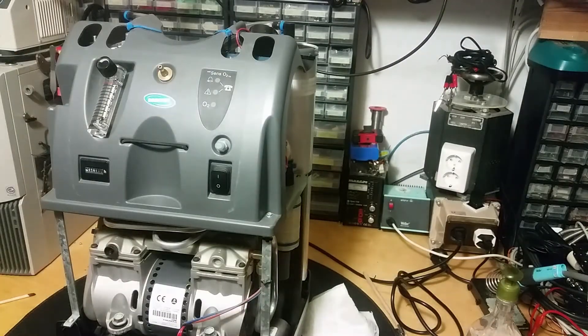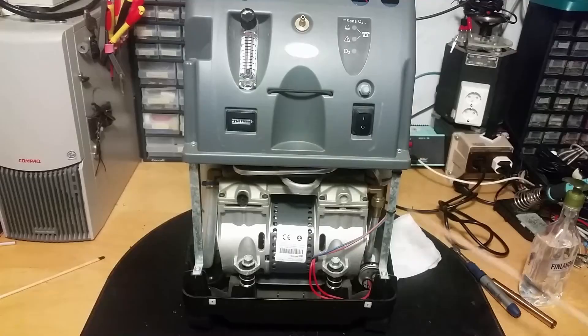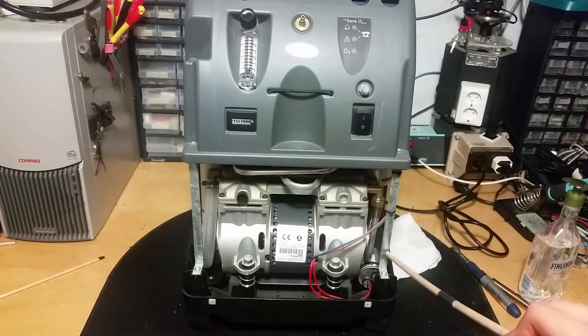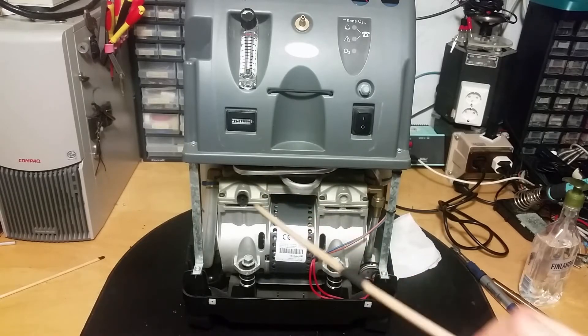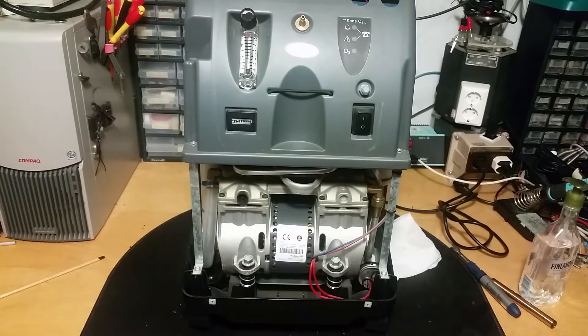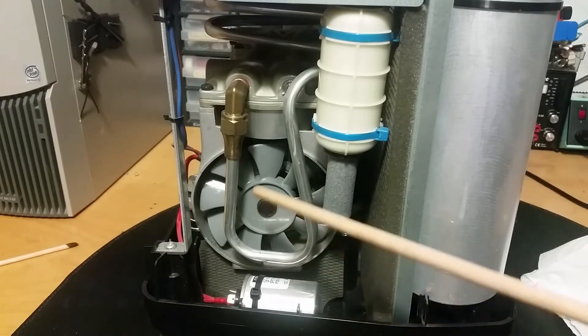Here you can see the internals. We got some sound insulation in here to make it a bit quieter. We got the compressor here — two sets of pistons with a motor in the middle. There's a starting capacitor here, the discharge going down and around, a coil up top, and it goes to the back. Here's the side of it with the capacitor.